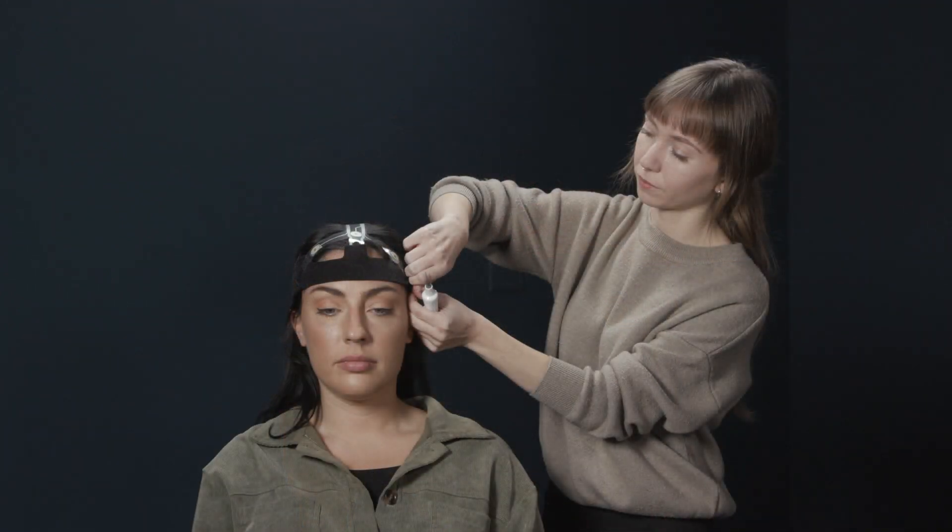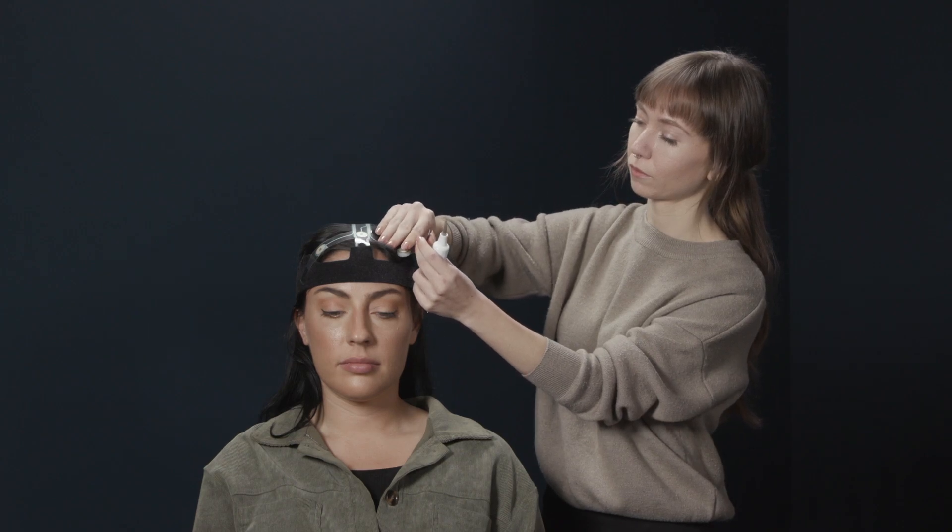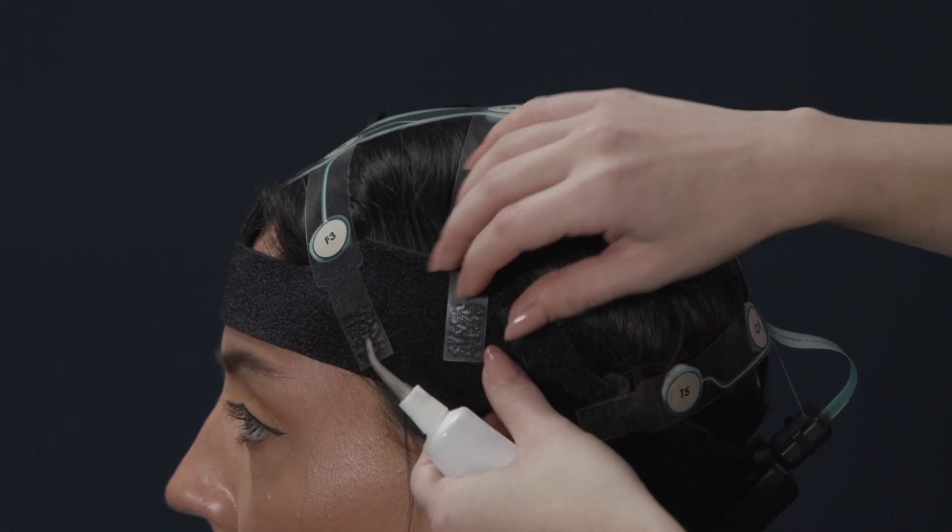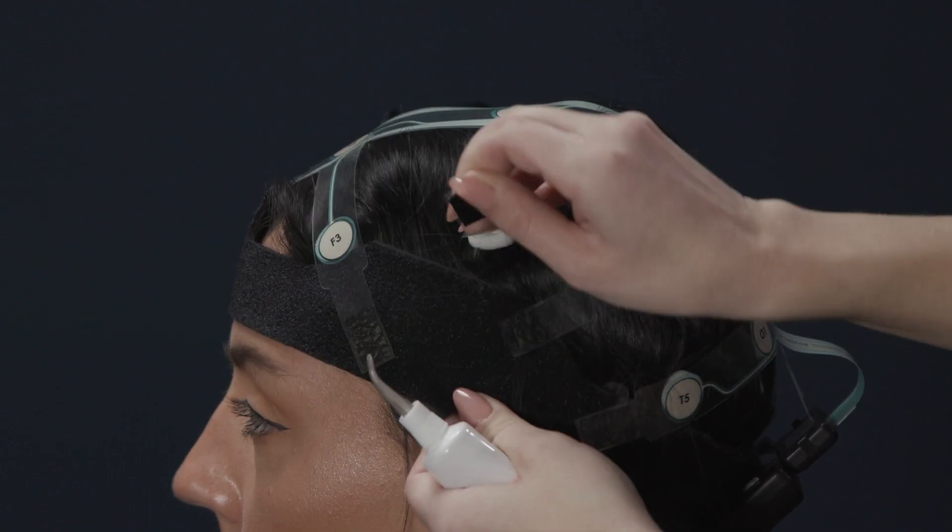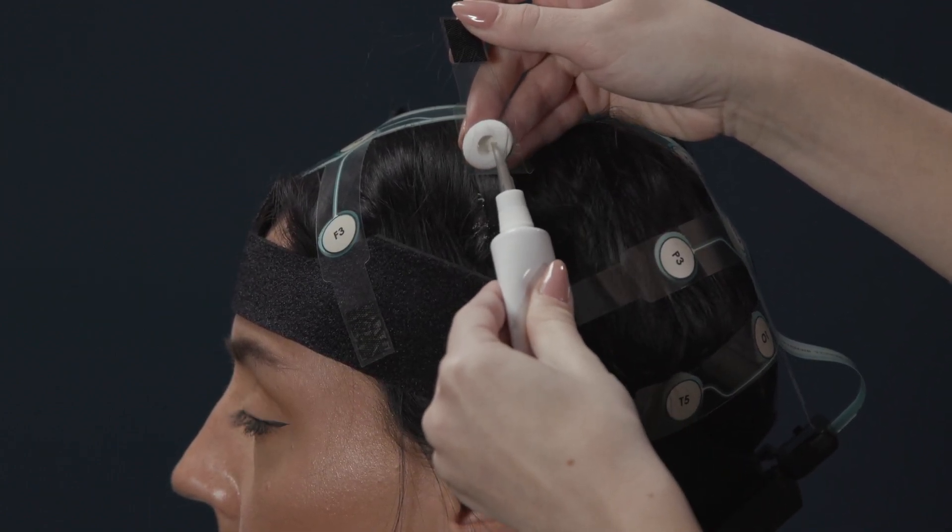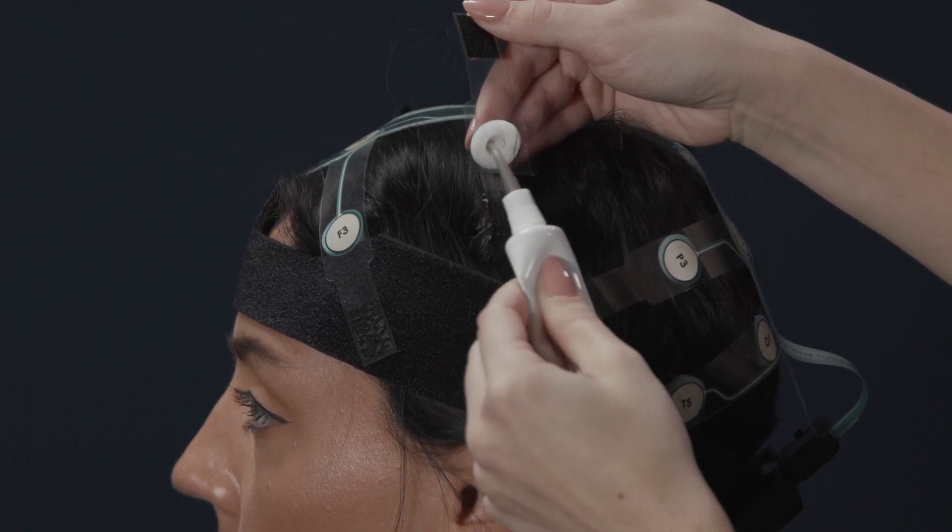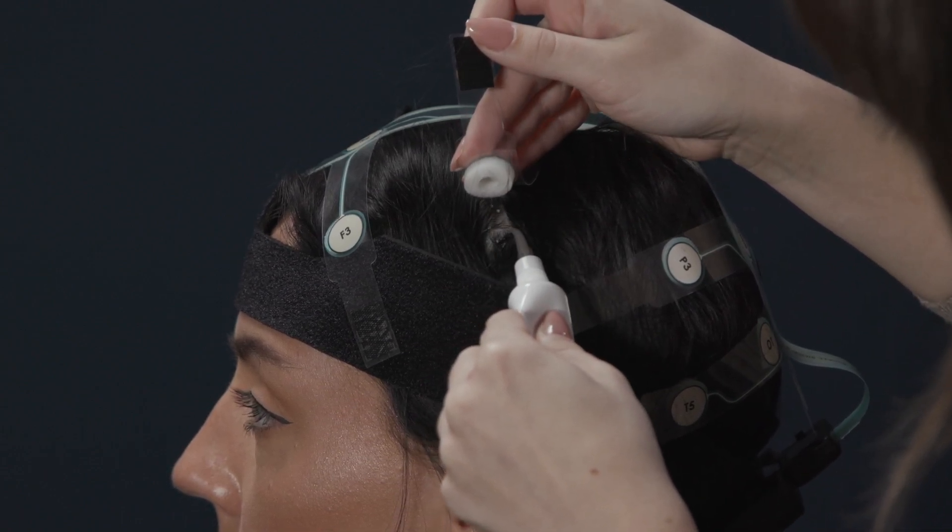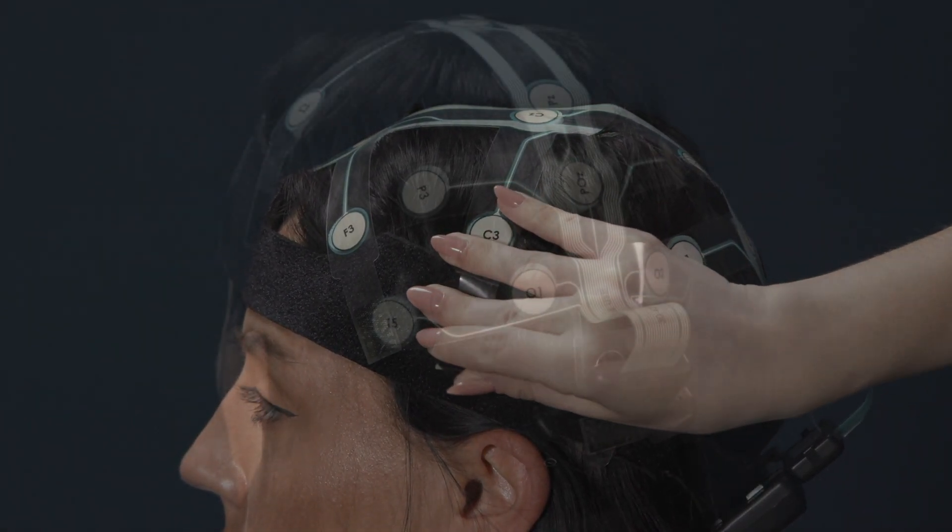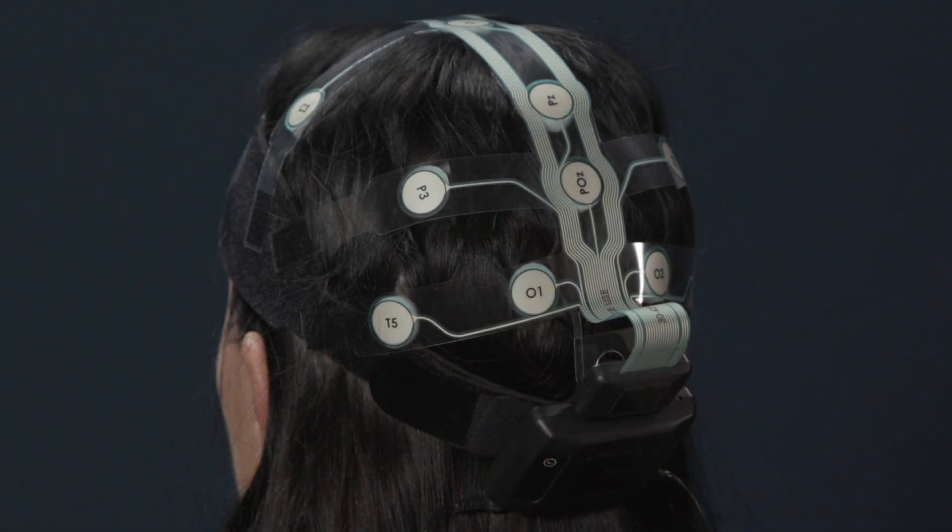It is now time to refill and position the remaining foam sensors on top of parted hair to give the best scalp to sensor connection. One at a time, working front to back, lift each strip arm. When lifting the strip arms, hold the bottom of the strap and peel the arm off the neoprene to help the Velcro release and keep the strip from moving out of place. Fill the donut hole with cream. Part the hair and lay the sensor down directly on the cleared scalp for the best connection. Once all the strip arms are fastened to the strap, ensure that all foam sensors are lying flat against the head and are slightly compressed. Please note that excessive pressure can have negative effects on both signal quality and subject comfort.